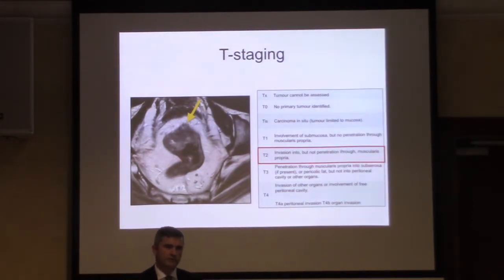So when you're assessing tumours, look at the thickest portion of the tumour, because that is where it will have infiltrated most. So it's not going to be at the margins of the tumour. It doesn't sort of think, well, I'm not that aggressive until I get to the very edge and I'm suddenly going to be aggressive there. So it's where the tumour's thickest.